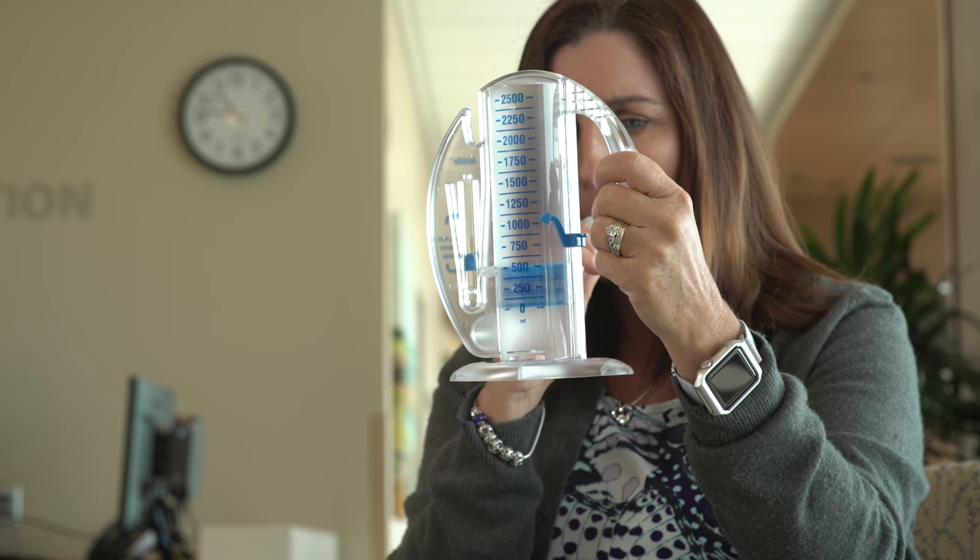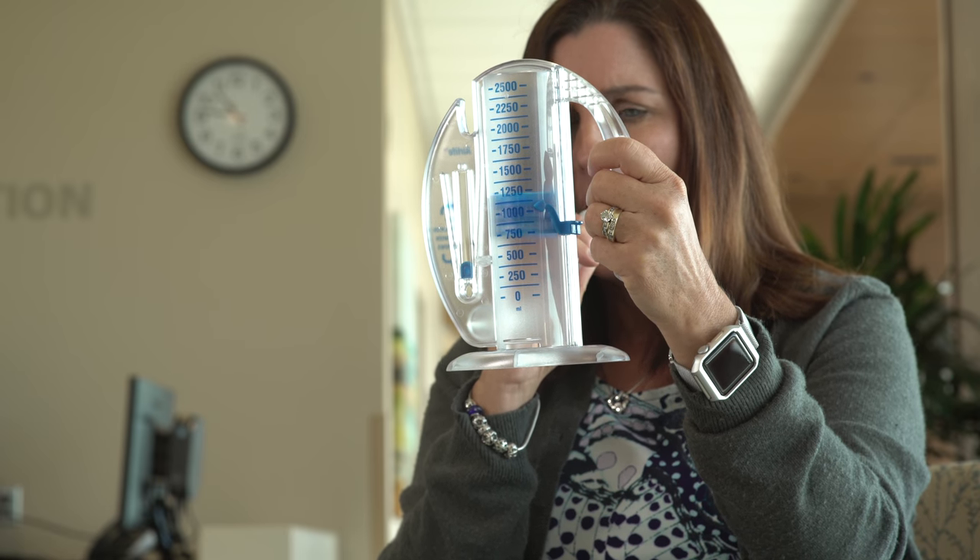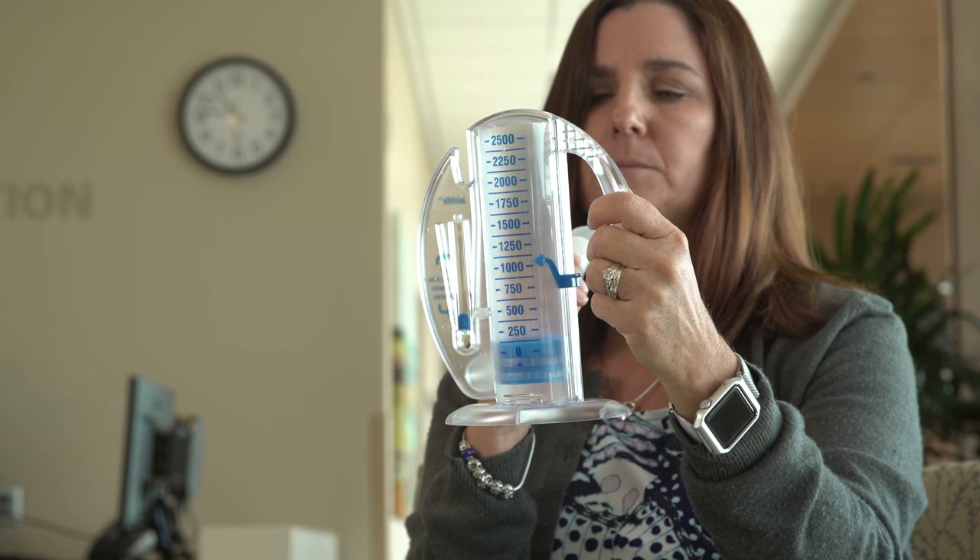After surgery, do these exercises at least 10 times every hour while you are awake, or as directed by your physician.